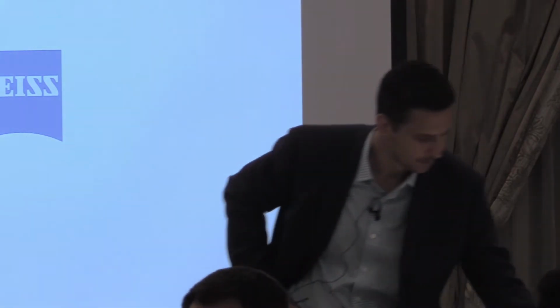A couple of questions on SITA Faster. With SITA Fast and SITA Standard, it's using an adaptive Bayesian algorithm with a certain error tolerance to get an estimate of the sensitivity. How does that error compare in SITA Faster? Because if we're using numerous different thresholding algorithms to track GPA over time, how does it account for greater error tolerance? And in that vein, does it take SITA Faster longer to detect change in GPA compared to SITA Fast and SITA Standard, which is, I guess, the current clinical standard for this group?